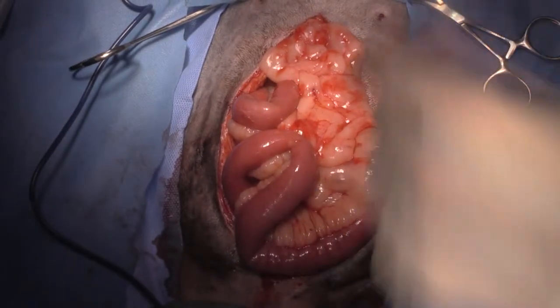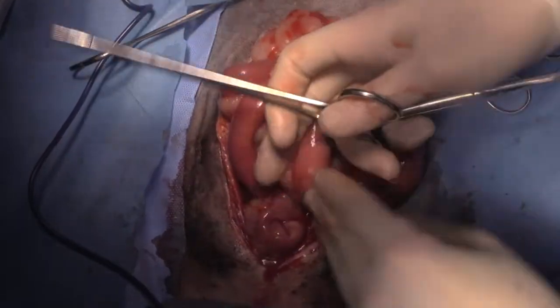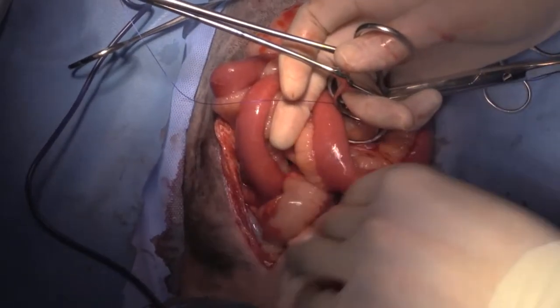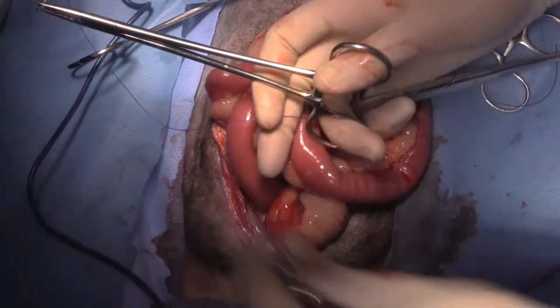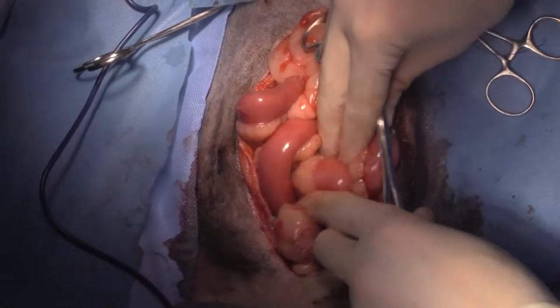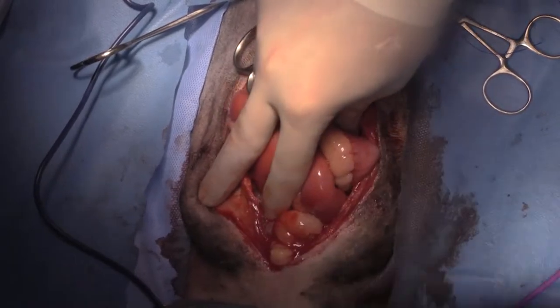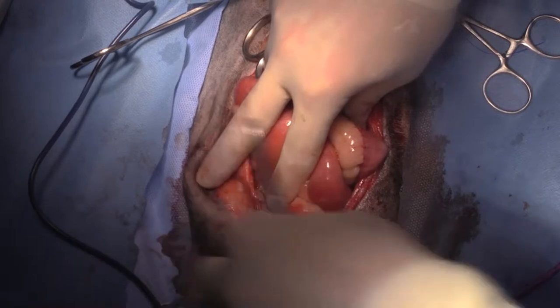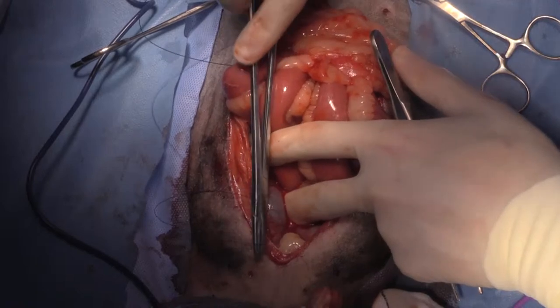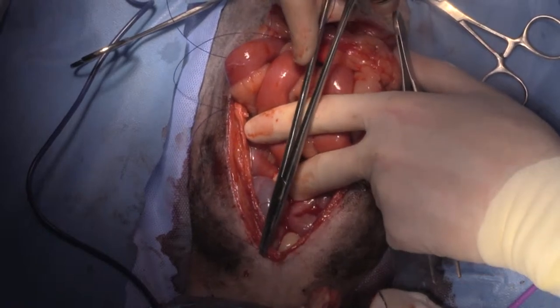And there's another quick question there. Teacher Tiger, don't you find a major duodenal papilla? That's a great question. We didn't do an enterotomy to find that. On the ultrasound before the surgery, we could visualize the common bile duct really clearly, and it wasn't dilated at all. The rest of the lobar ducts through the liver looked completely normal. And in the surgery at the start, I actually put a needle in just adjacent to the duodenal papilla, and we drew out an amount of just biliary fluid or bile-stained fluid. So I'm confident that the bile duct is flowing adequately, and so we didn't need to do the enterotomy and catheterize the papilla. So that's a great question from Teacher Tiger.